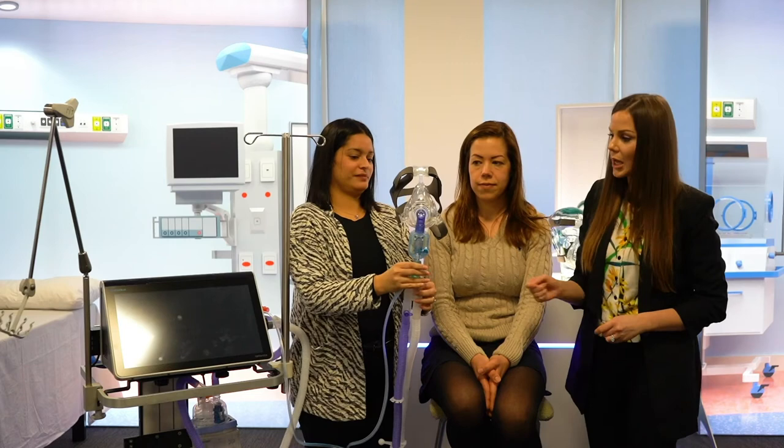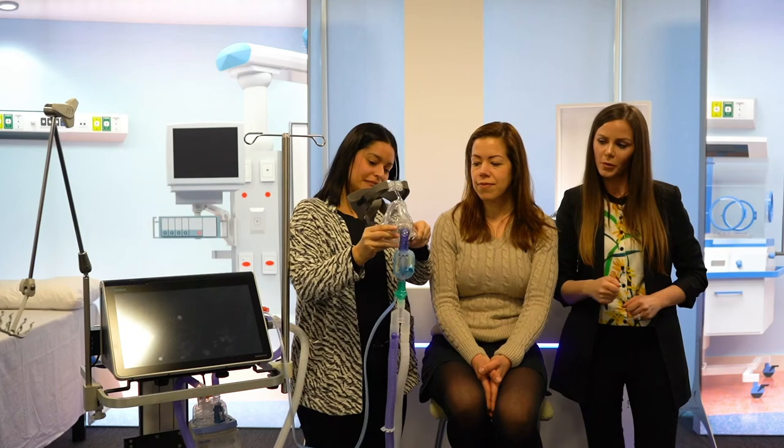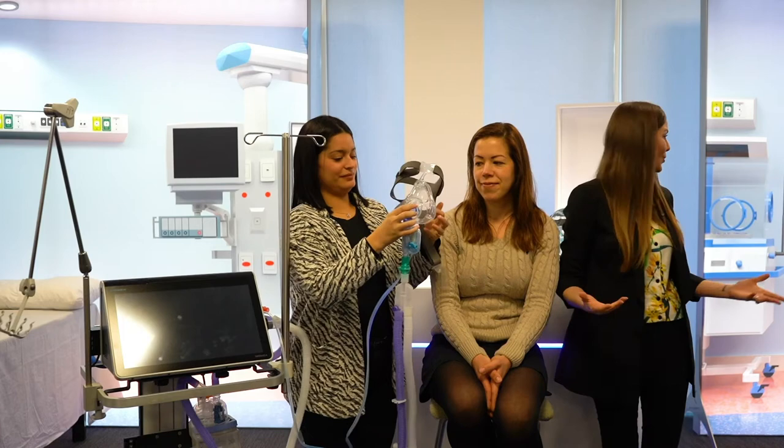So in order to put it on, if I get you to hold it, I'll talk you through it. What I would like you to do is unclip the bottom two buckles, okay? So we see these bits here. So it's almost like a push out action to release. Yeah, you've got it, push it out. Got to be a bit firm with it, yes, and the other one. Fantastic. This is great, she's doing all the work.